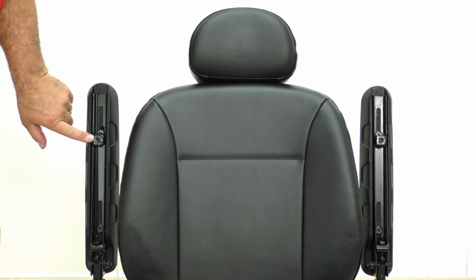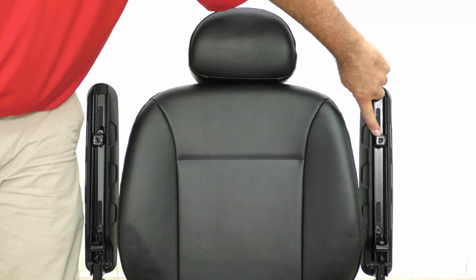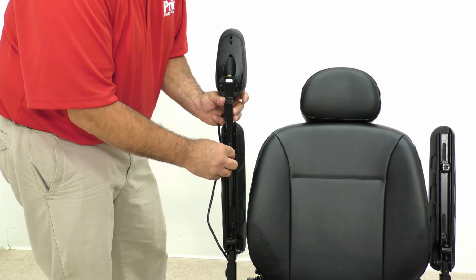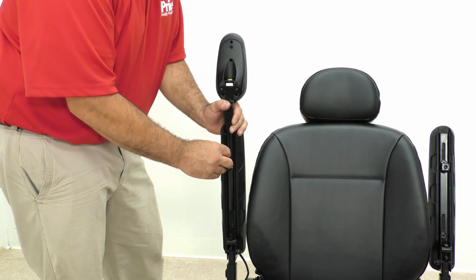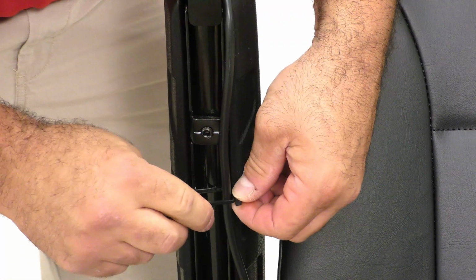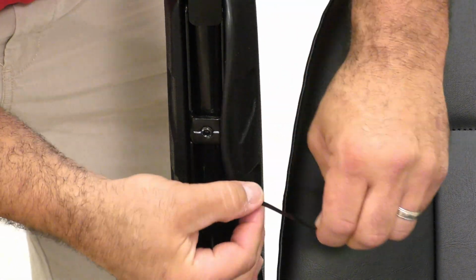Determine which side the joystick will be mounted. The armrests are universal, meaning they are not side-specific. Place the joystick mount in the armrest slot and tighten the set screw with the 4mm Allen wrench. Use the wire ties to secure the harness to the armrest.